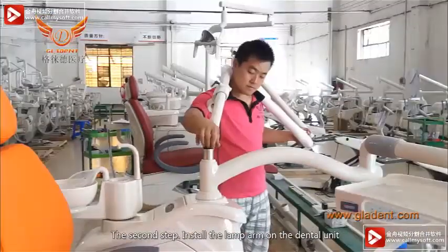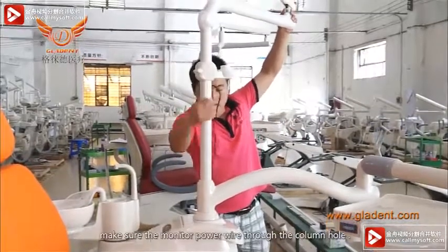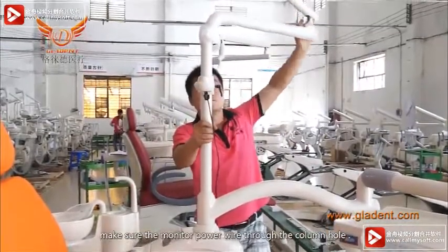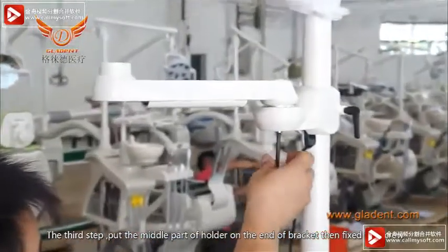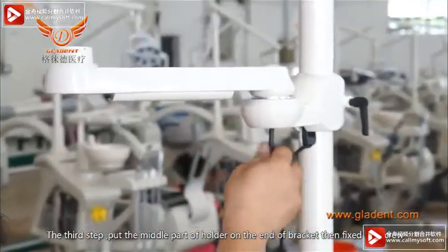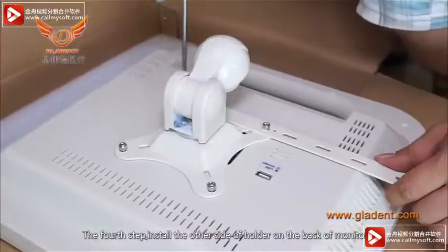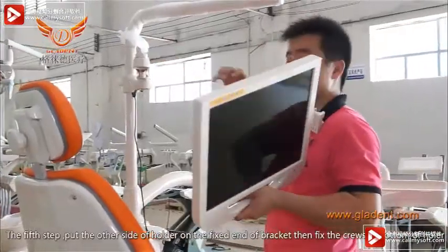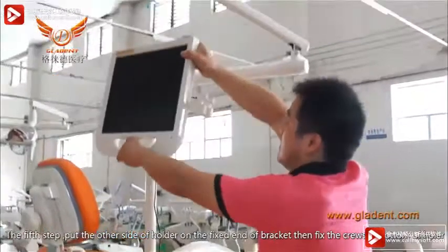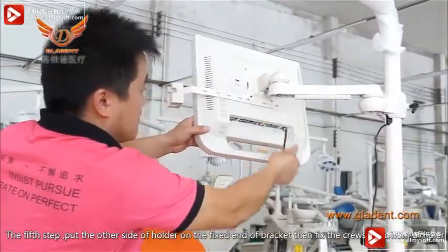Make sure the monitor power wire runs through the column hole. The third step: put the middle part of the holder on the end of the bracket and fix the screw. The fourth step: install the other side of the holder on the back of the monitor. The fifth step: put the other side of the holder on the fixed end bracket, then fix the top and bottom of the holder.